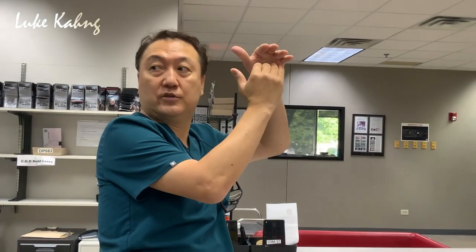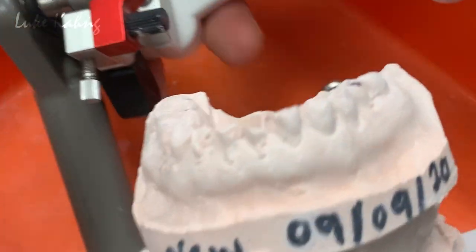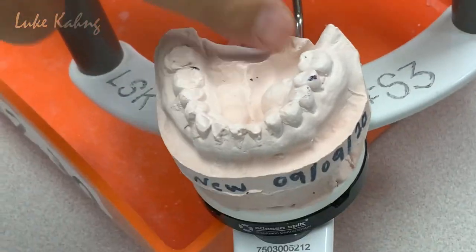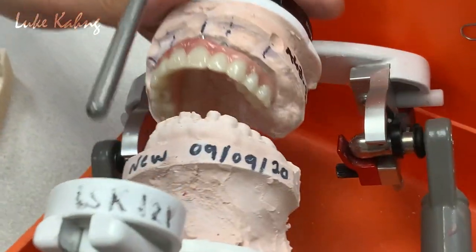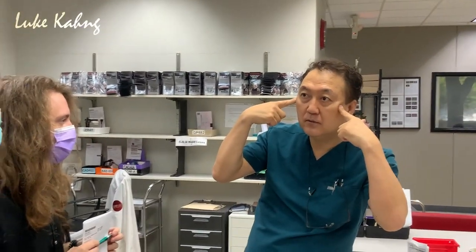So take a picture. If you can take a picture, this is good. You don't need this one, but this one I want to see. That one I see, four teeth, the lower teeth just done. It's grinding, everything heavy grinding, right? It's gone. The crown is cracking, it's gone. Here's more of a problem: I want contact. I want the lower grinding, whatever, in contact, everything touching. Try to, then we support it. Then their TMJ is better. With one side touching, think about the other not touching, something's not right.